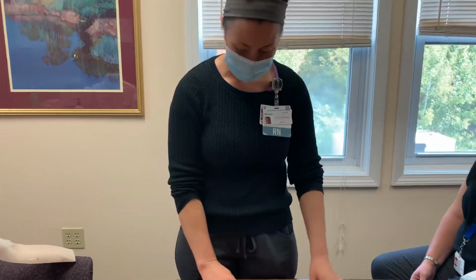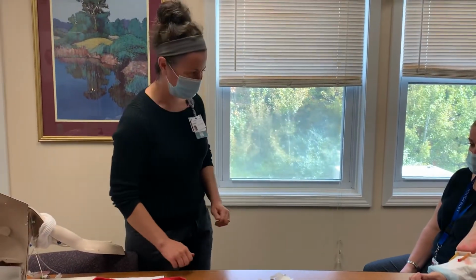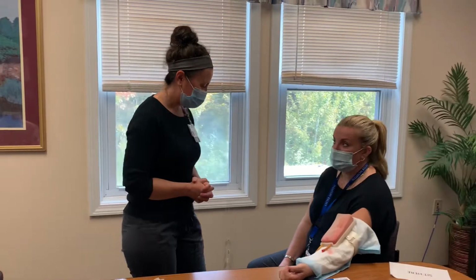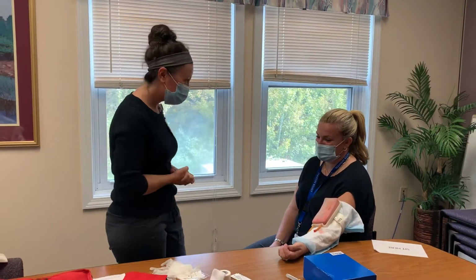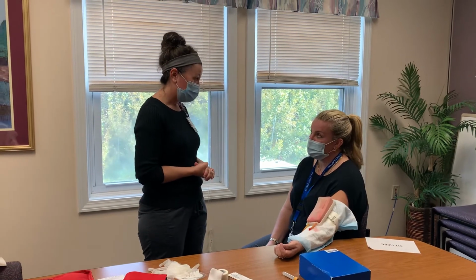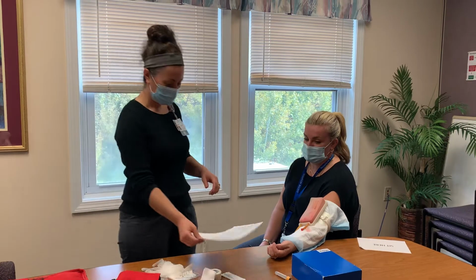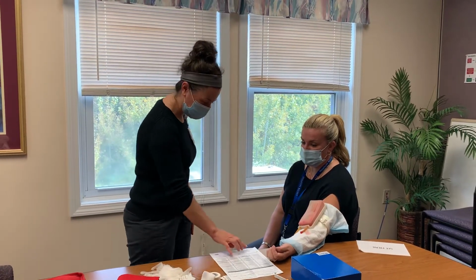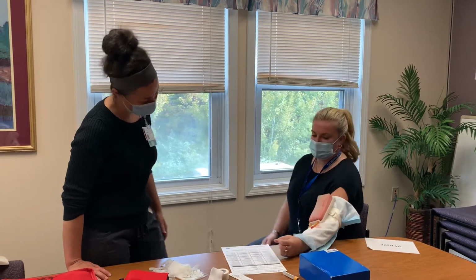All right. So I'm going to the patient's house. Well, hi Rachel, how are you doing today? I'm good, thank you. Thanks. So I'm here to draw some blood, and for your doctor. Is that okay? Yes. Okay. I'm gonna have you sign right here. Great, thank you.